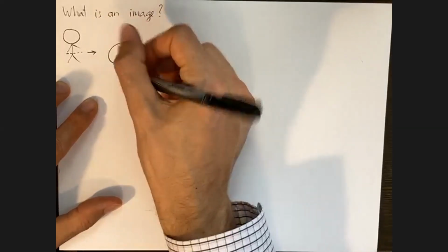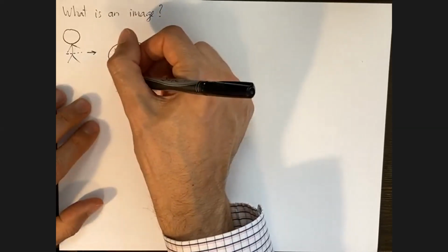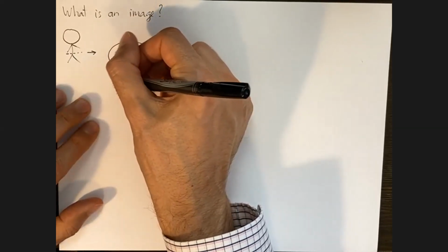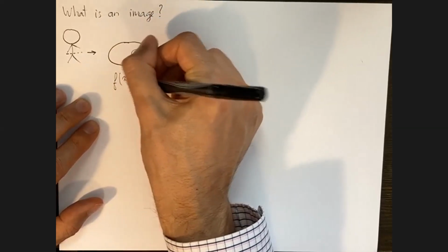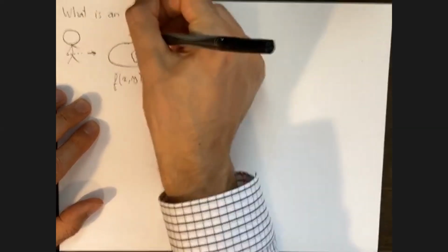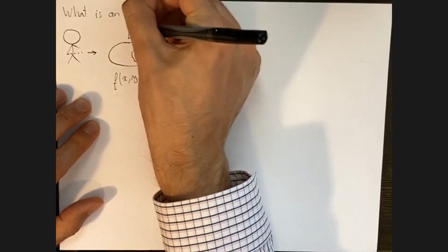So mathematically, this here is a function because it's a physical quantity. It's the distribution of the radiotracer. It's concentration over space. And it's a function of 2 variables, f of x and y, where x and y are the coordinates in the plane, shown like here.